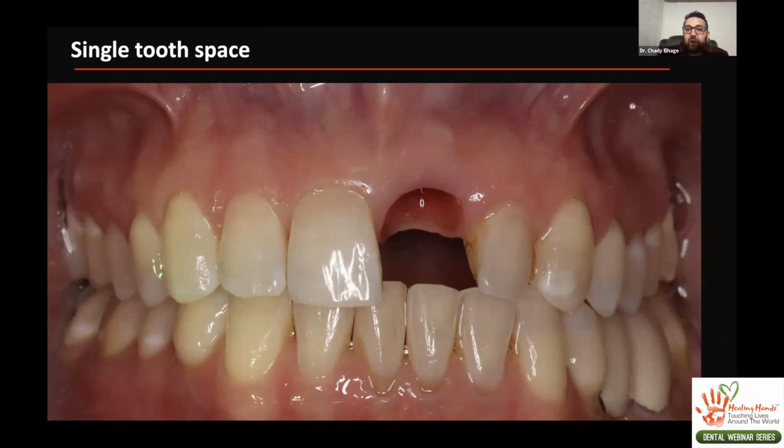Nowadays with scanning technology, it makes things a lot easier because you can scan the restorations before you ever do anything and replicate what was there. You can do a scan at this point and scan the tissues, and then you can actually replicate the neighboring central incisor. You can use the software and just mirror image that tooth. So that way you're developing a tooth that fits the contours that you've developed, and tooth form is identical to what is there. And then with a good ceramist, with shading and coloring, you'll have something that looks very, very natural in there, and hopefully satisfies your patient.